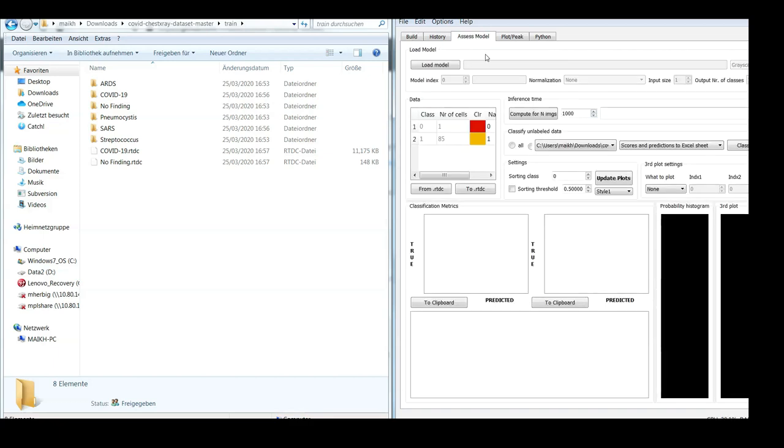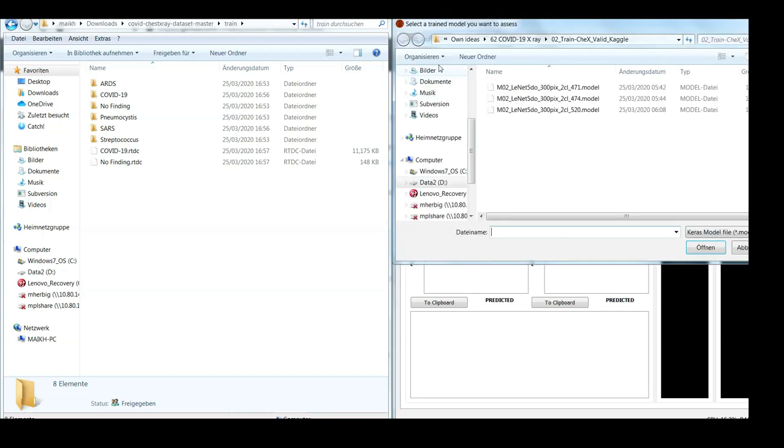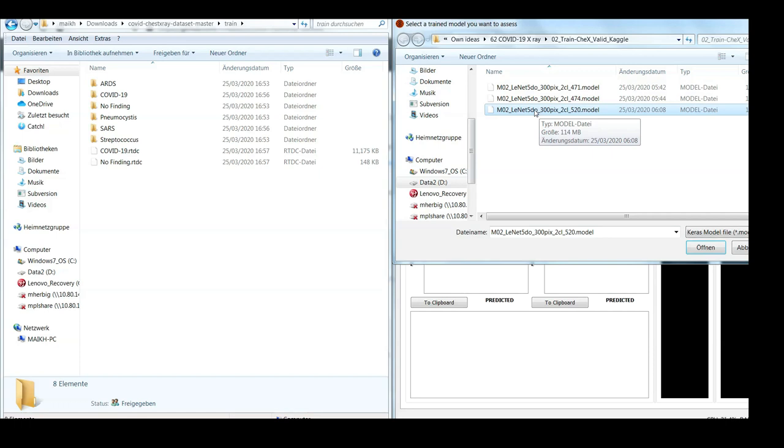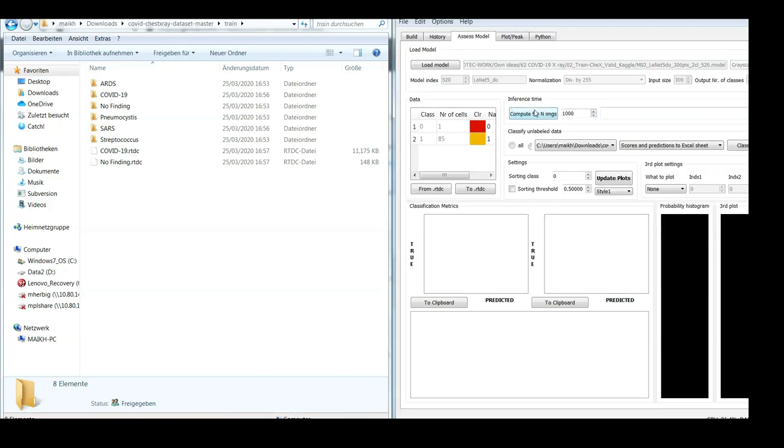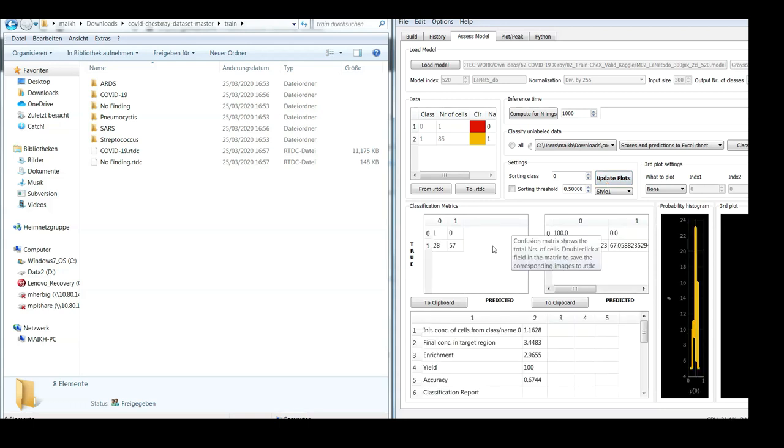And next we would like to assess one particular model, let's say the best model that we found during the last fitting process, the model of index 520. And let's apply it.